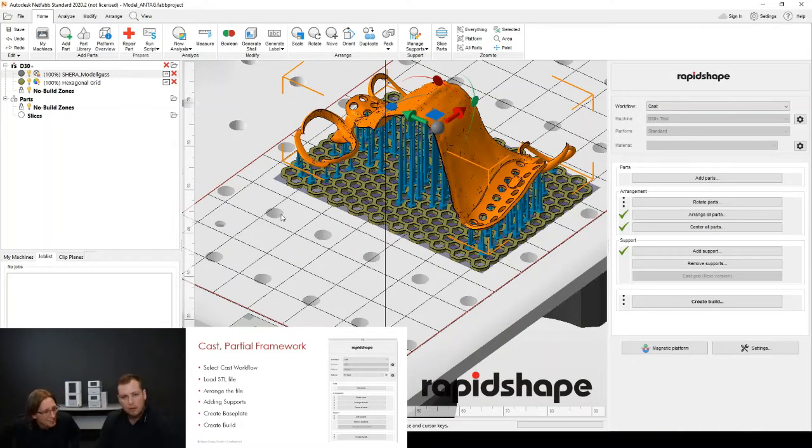We just have a question here from Gabriella. Gabrielle is asking about crown and bridge pins that aren't necessarily working always on the customer side. And the other question is that the parts that he imports, he needs to manually adjust the height from the build platform. Is that correct, Gabriele?